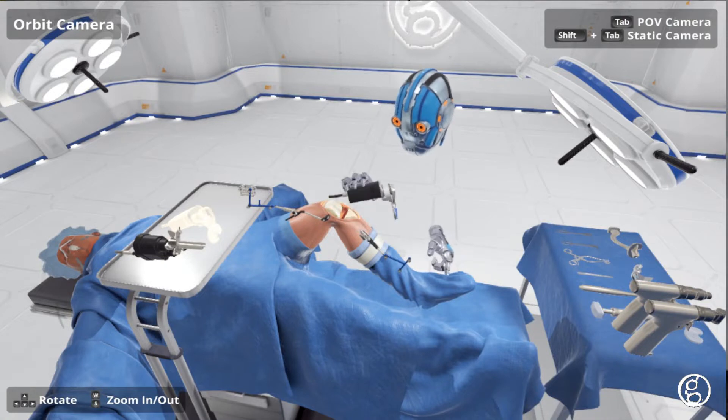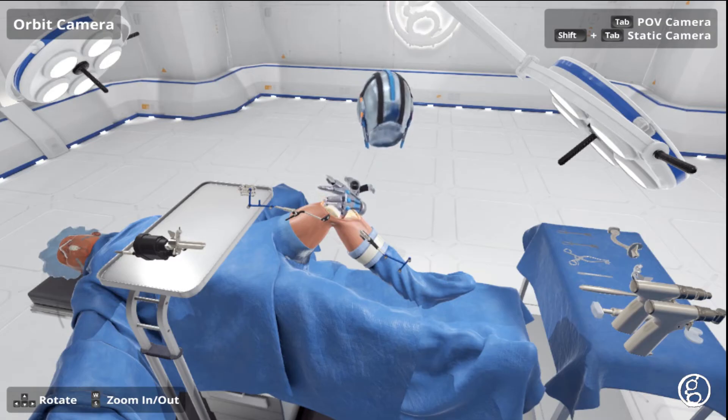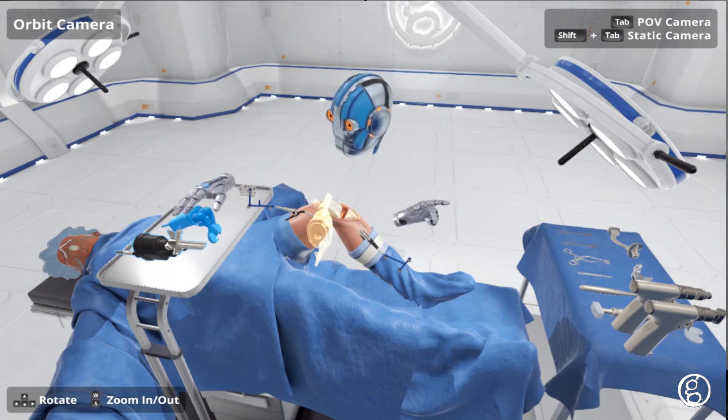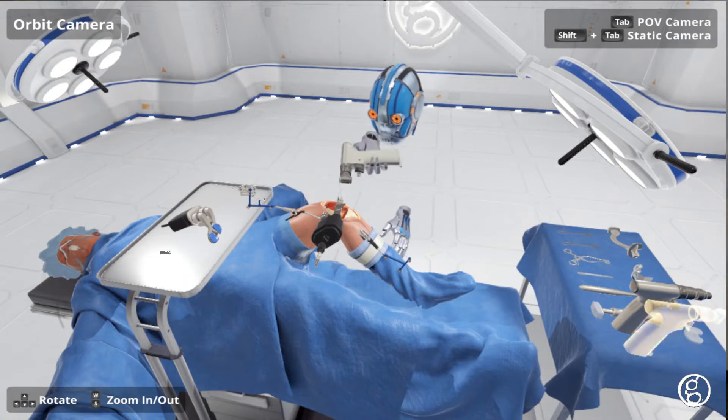Return it to the Mayo stand. Select the robotic femoral resection guide or grab the bone saw. Resection — making the final cut.